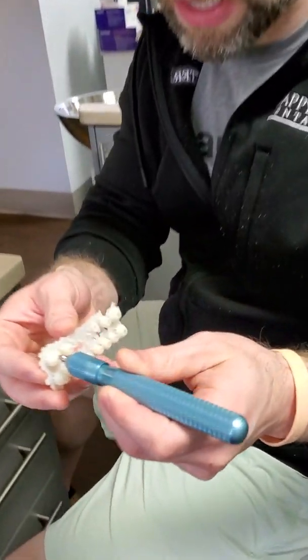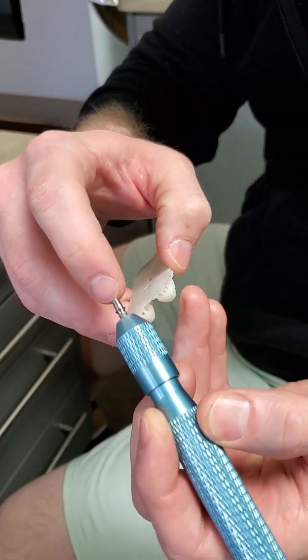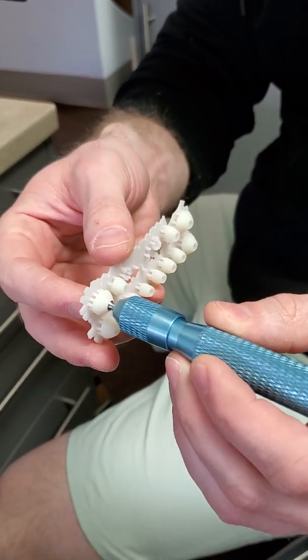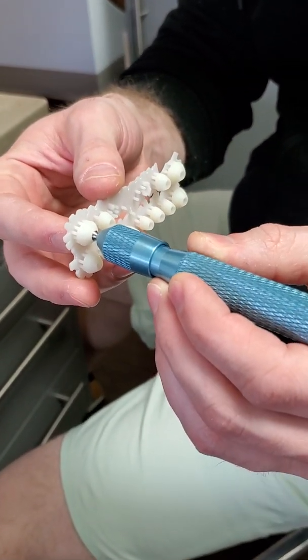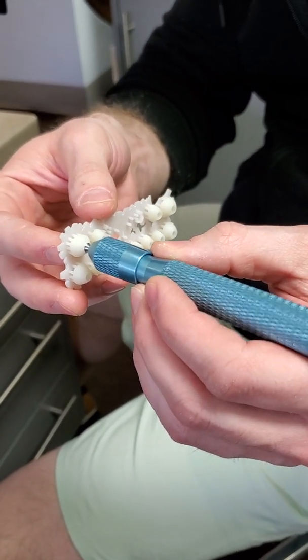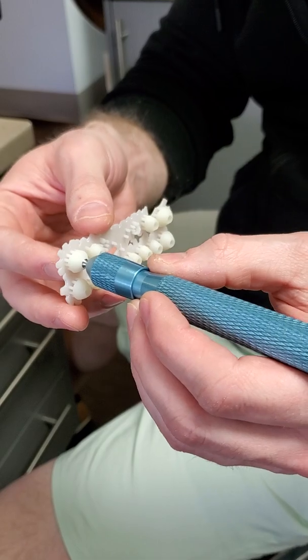And if you look closely, there's the notch on the tie base, and there's actually a notch cut in there. You probably won't see it in this video, but it catches in there. There's a little bit of play. That's okay, because this is not going to undergo load as far as chewing on it — not more than any other healing abutment.